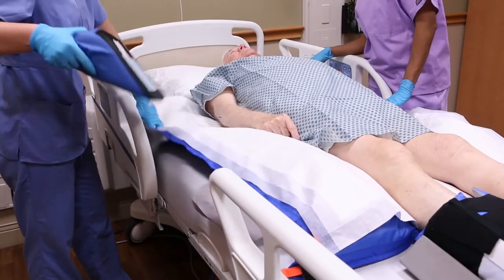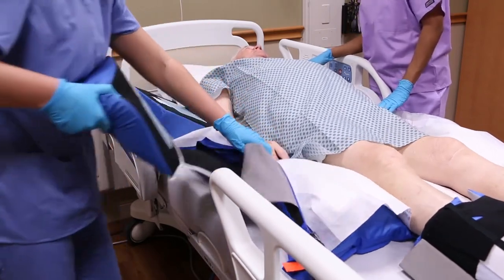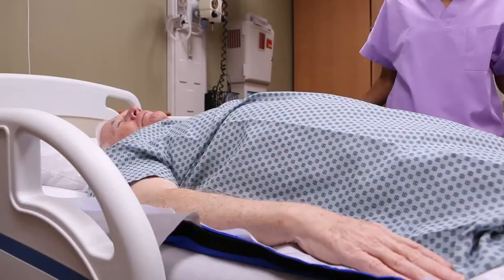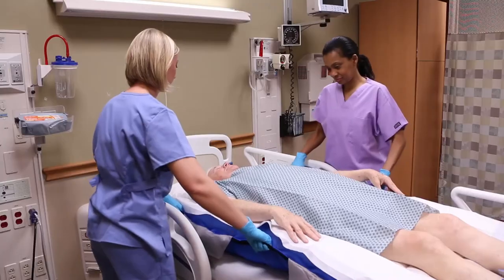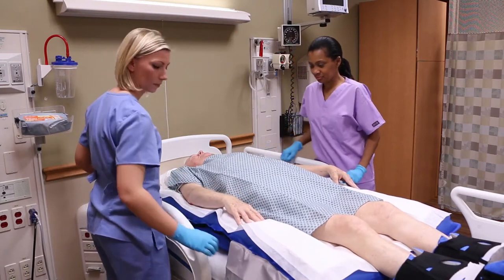Before boosting the patient, remove the wedges. Turn on the booster pump. Once the glide sheet is fully inflated, use the black handles to move the patient to the desired position. Turn the booster pump off.